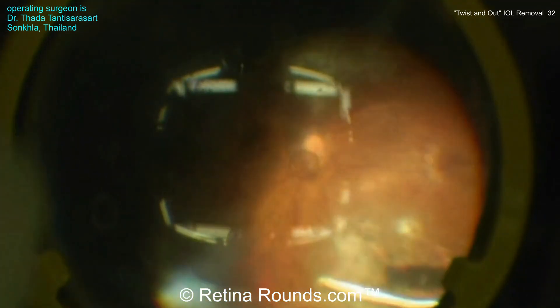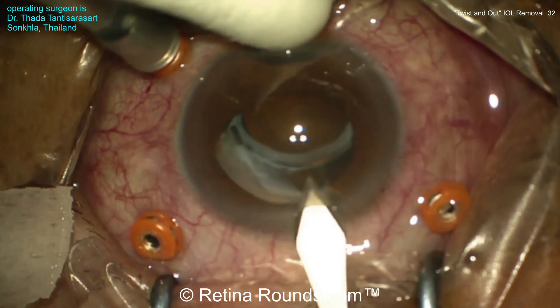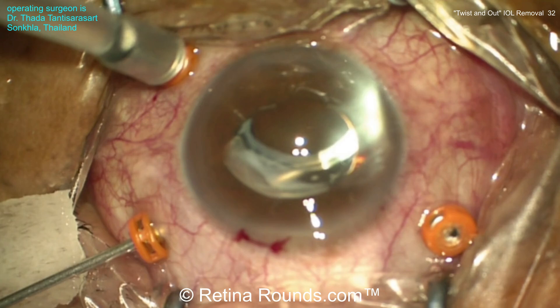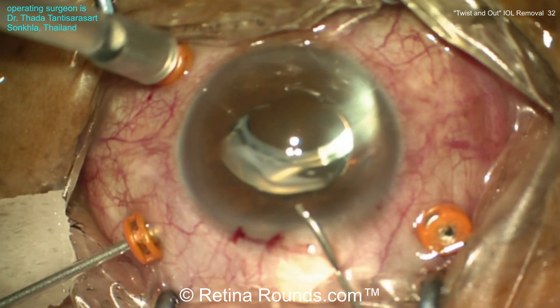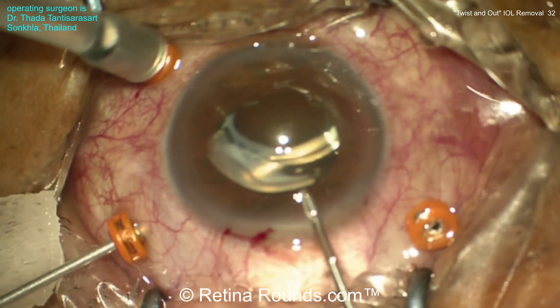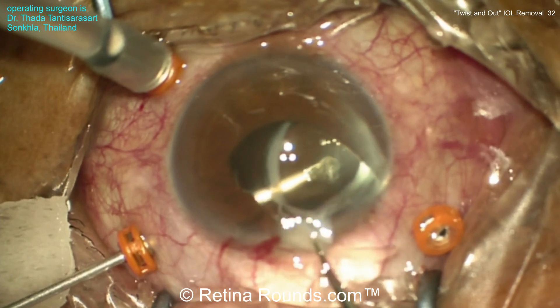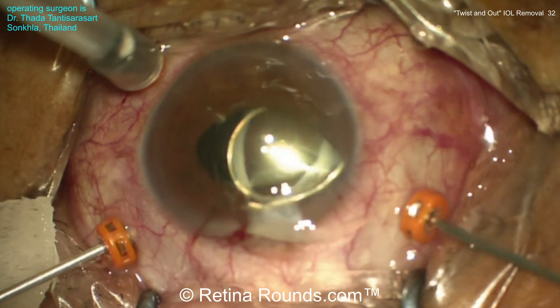This vitrectomy is being performed for a patient who has a history of CMV retinitis. Now going at half speed, a clear corneal wound is being created. This technique has been described in small corneal incisions up to 2.2 millimeters, but we're going to be sewing this wound shut given the vitrectomy, and so making a larger incision can make it easier to externalize the lens. Some dispersive viscoelastic is being put in to protect the corneal endothelium, and that haptic is being externalized through the clear corneal wound to hold it in place while the anterior vitrectomy is being performed.